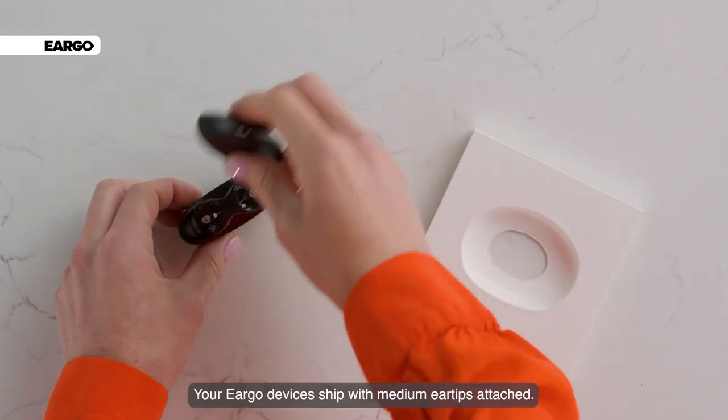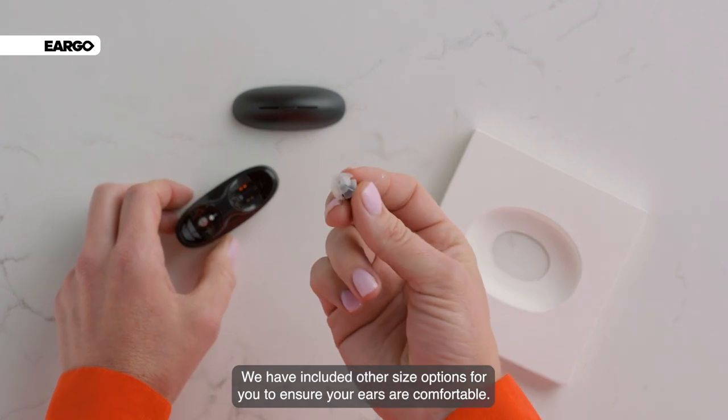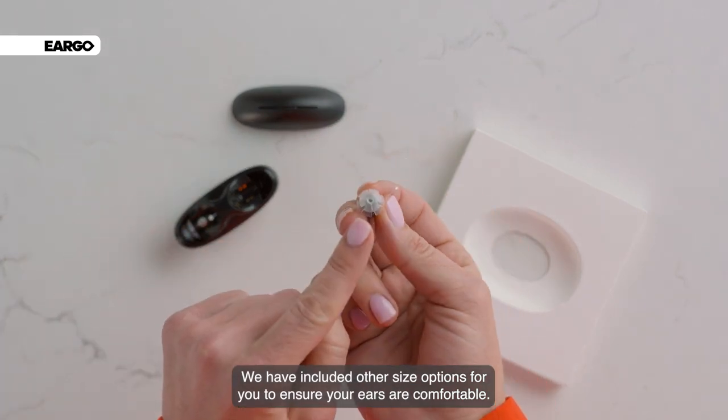Your Eargo devices ship with medium ear tips attached. We have included other size options for you to ensure your ears are comfortable.